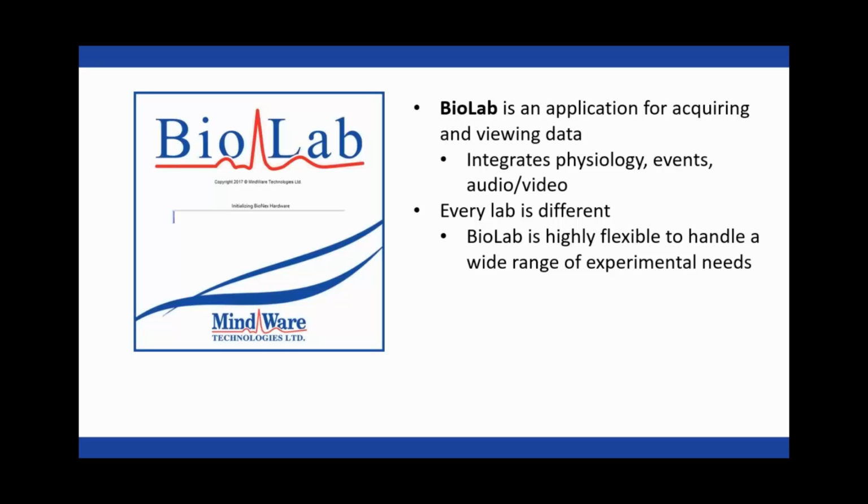It integrates the physiology that you're recording with the events that are coming in, whether they're from a digital event source such as a stimulus presentation application, or from a MindWare mobile, or from the keyboard. And it also acquires synchronous audio-video recordings with your physiology. But every lab is different, and the needs of every researcher are different. As such, our equipment and BioLab are highly flexible to handle a wide range of experimental needs.